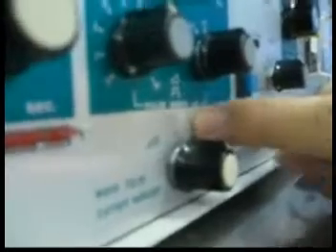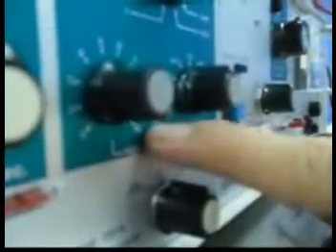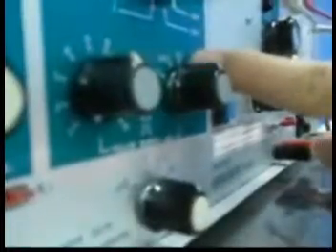After you know the chronaxie value, if you select the monopolar technique for partial denervated muscle, you can set the parameters. First, select the waveform, which is triangular waveform. Pulse width is greater than or equal to 1 and less than or equal to 10; I adjust it to 5 and 1.